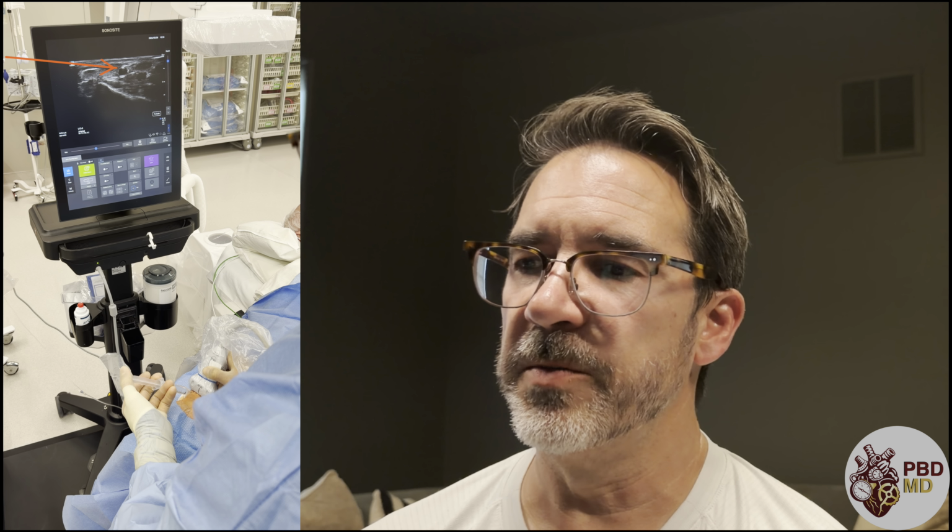So up in front of me, there's an ultrasound machine, and there's a dark circle that's, if you look close, pulsatile. I'm trying to point it out with the red arrow here. So basically I have the ultrasound probe in my right hand. I have an anesthesia needle on my left, just giving some lidocaine to numb up the area.